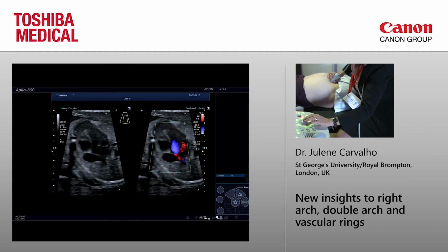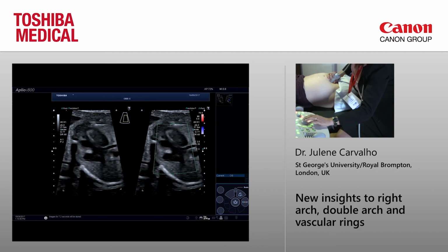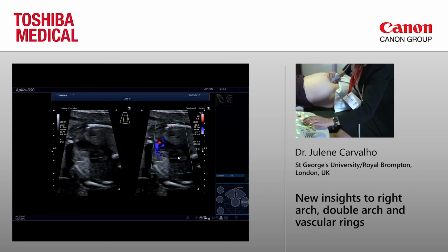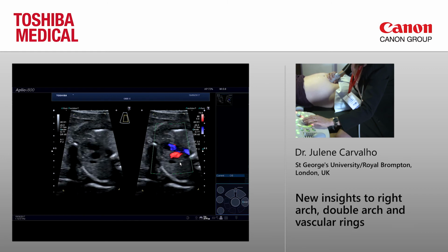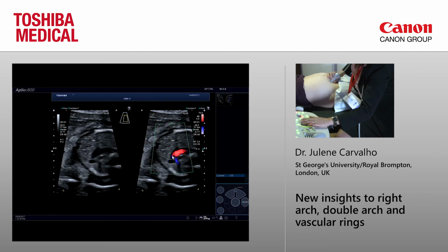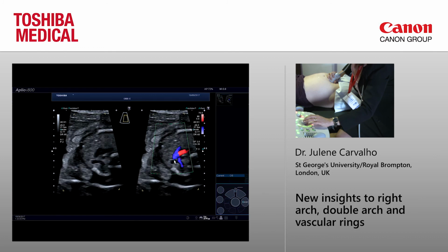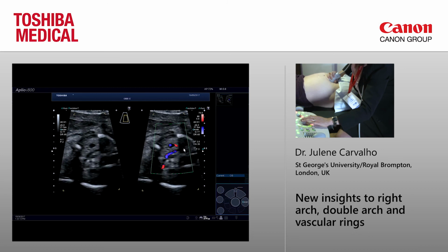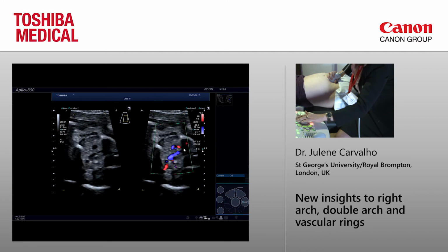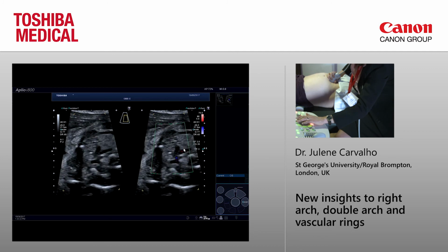So if you are on your 4-chamber, left ventricular outflow tract, screening views, bifurcation of the pulmonary artery, 3-vessel view, 3-vessel trachea view, a little bit higher up from there, there is your right subclavian. This is the innominate vein, right SVC, right subclavian artery, normal origin, trachea, and then that's the left subclavian artery. Now I'm going to lower the velocity a little bit to see if we can capture the subclavian arteries.